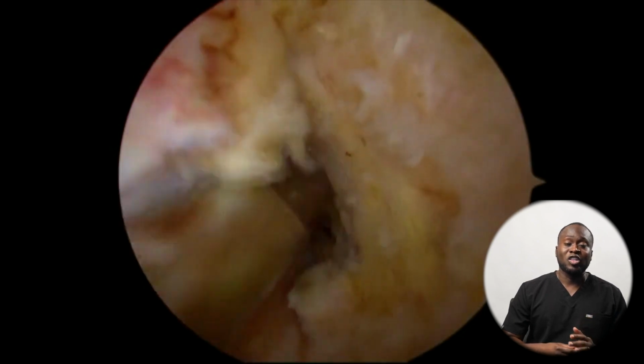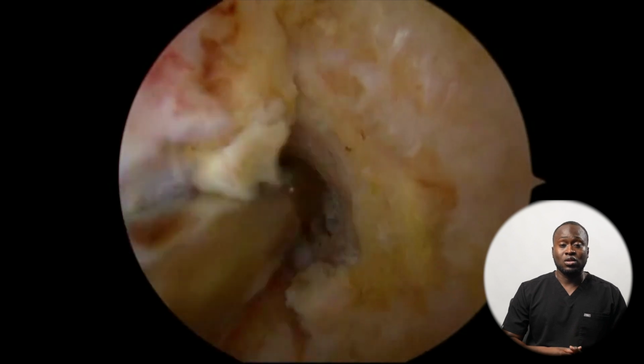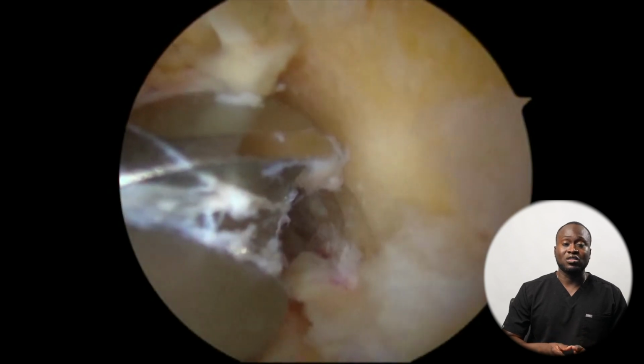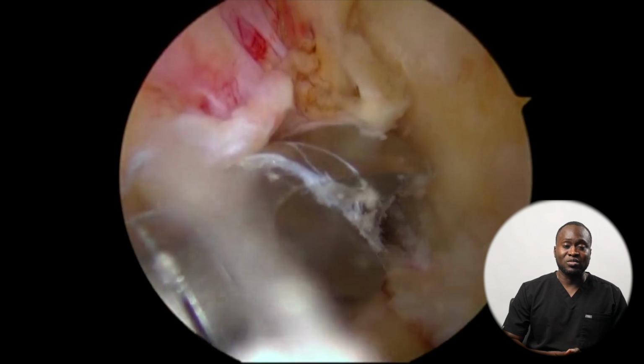Once we've adequately cleaned that up, once we've gotten it out of the way, the key now is to drill those tunnels I was talking about. So we use special guides and instruments to drill those tunnels in exactly the right size for each patient. So it's all individualized. There's no one size fits all. Everybody's different when it comes to this.